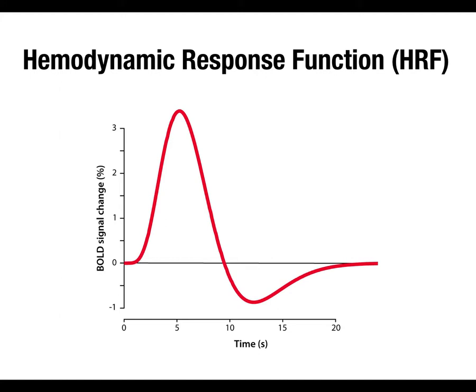So that's super slow when you consider that when we look at EEG, ERP, in the first second after stimulation, you can see like a P1, an N1, a P2, an N2, an N400, a P600, right? You can see all these different fluctuations in brain activity that we know are coming from different brain areas and actually reflecting different cognitive processes. When we're looking at fMRI, all that gets smushed together because all that different sort of electrical activity has all happened a long time ago by the time anything is measured with the fMRI response.